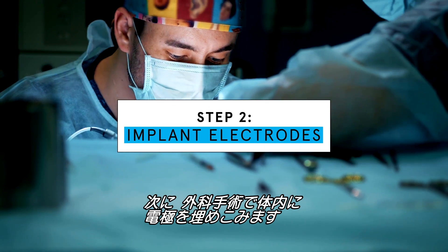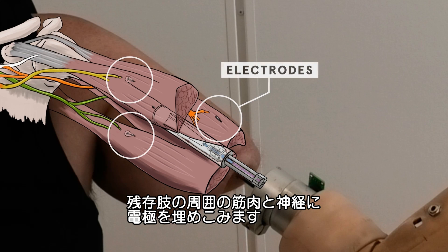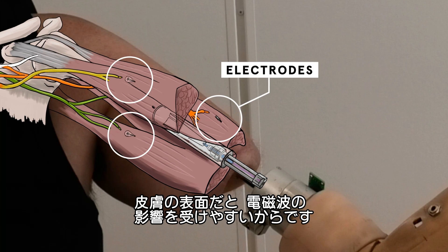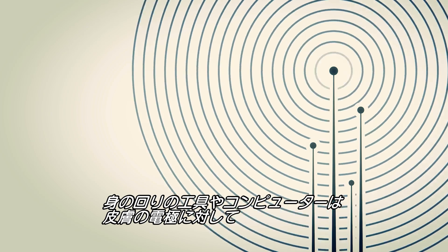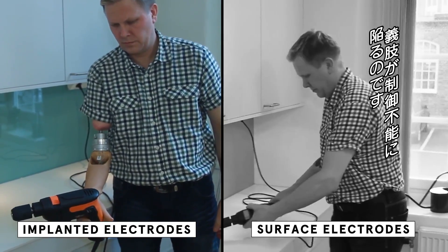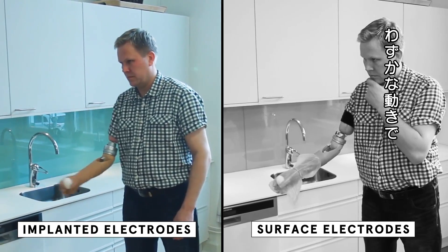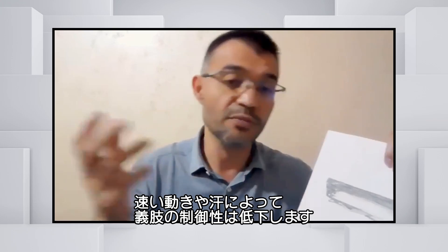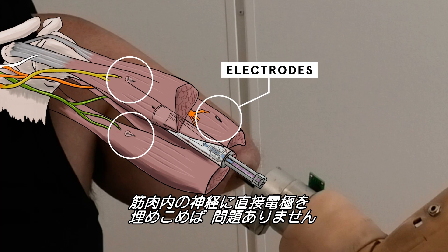The next step is to surgically implant electrodes inside the body — placed in the muscles and nerves around the residual limb. Electrodes on the surface of the skin are susceptible to electromagnetic interference from tools or computers, causing noise that makes the prosthetic uncontrollable. Even moving your arm can generate a motion artifact, and sweat makes the prosthesis less controllable. With electrodes implanted directly inside muscles and on nerves, you don't have any of those problems.